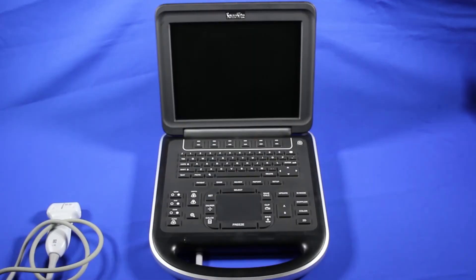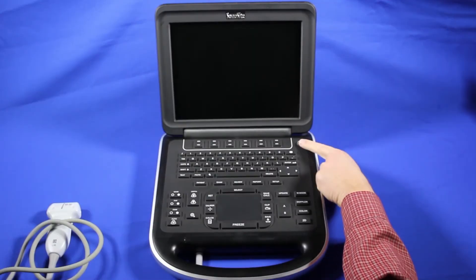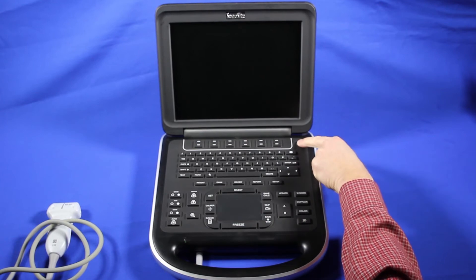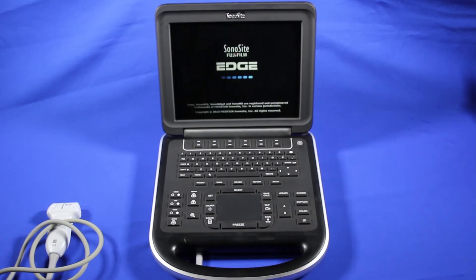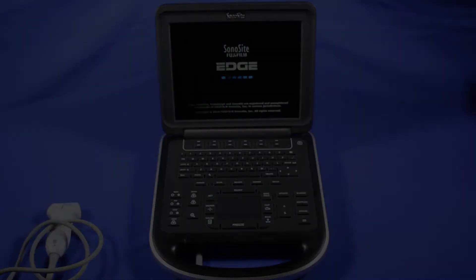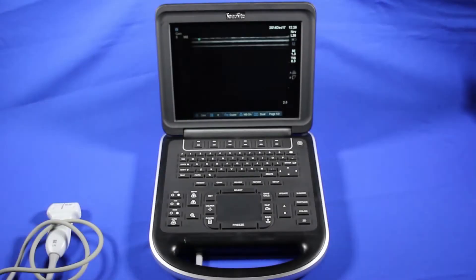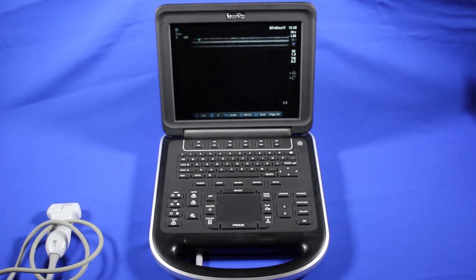To get started with the SonoSite Edge, press the power button key in the top right-hand corner. Once the machine is booted, you are ready to scan. But first, let's take a look around the system and get to know it a little bit better.